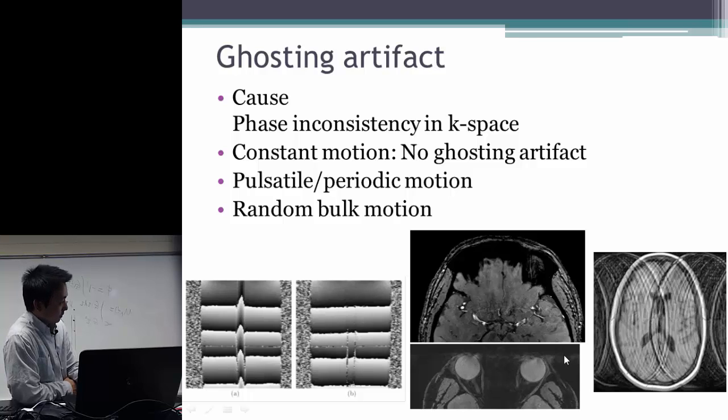Usually you may see a lot of ghosting artifacts with different strengths and different spatial frequencies that overlap with each other, so you may not easily tell.